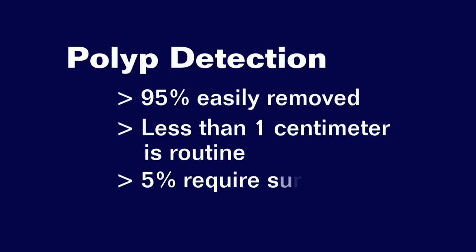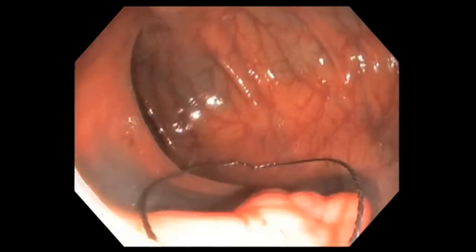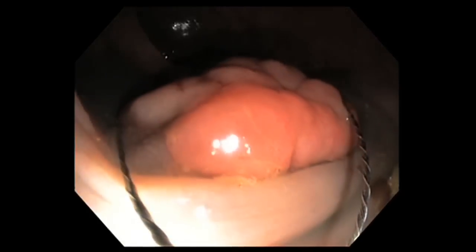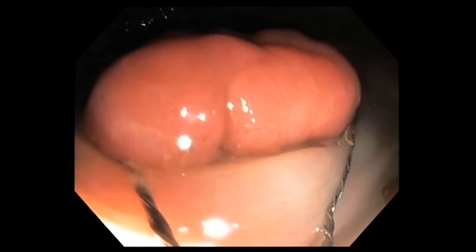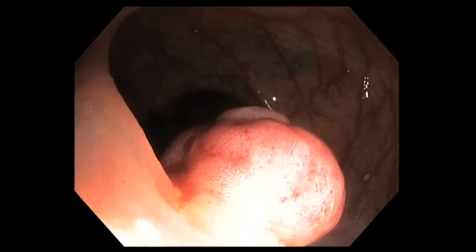Five percent are larger polyps and require a more sophisticated technique. Boston Scientific makes snares — good snares. There's the snare coming out. I'm going to put this snare around the polyp, tighten it up, and then put some electricity through the snare. The electricity will heat the wire up and it will cut through tissue, and they also coagulate at the same time. Here is the removal of that polyp.